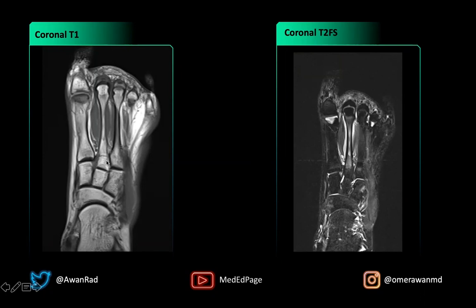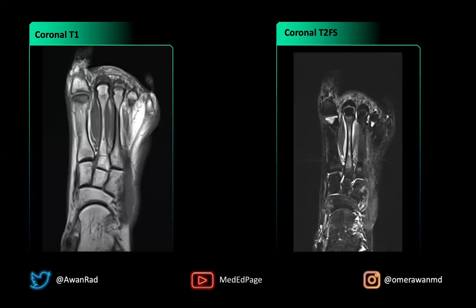This is not going to be a case of juxtacortical chondroma because we don't have a chondroid tumor here. There's no saucerization of the cortex that often occurs in juxtacortical chondroma, and we have no T2 lobulated bright signal suggestive of chondroid tumors. And this is not an osteoid osteoma or bone-forming tumor because, although those do incite bone marrow edema on T2, there's often cortical thickening or nidus with central calcification in the cortex in osteoid osteomas — which we don't see here.